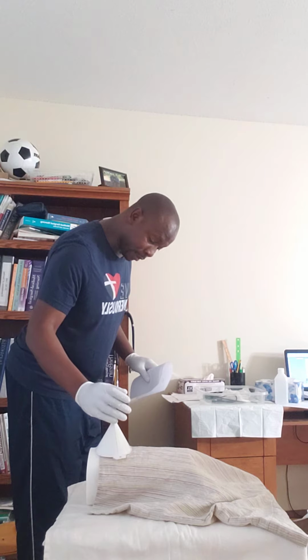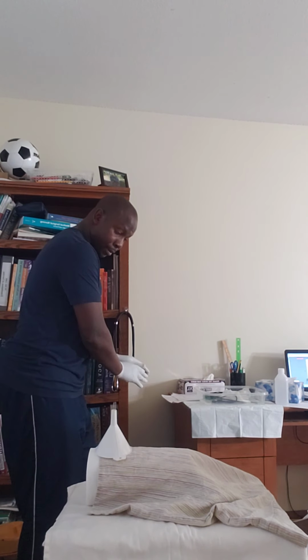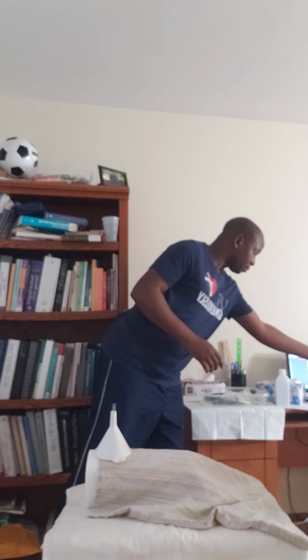Actually, this one is in place. I'll scan everything, and then I'll throw everything into the biohazard container or per facility policy. Then after that, my patient is good. I'm going to make sure he's okay. Then I'm washing my hands.